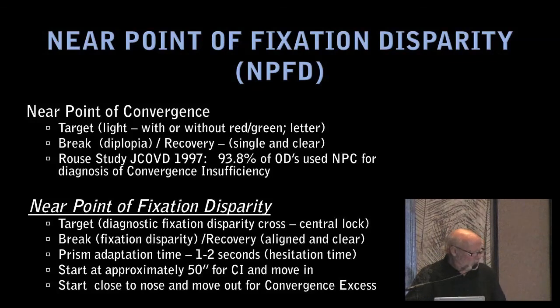Again, we take this target, and I'm using the large one to make it easier, and we're bringing it in until a fixation disparity manifests that cannot be recovered within a second or hesitation beyond that. Is it still sliding? Okay, now on the way in, I'll say, is the letter E clear? Yes. Tell me when the arrows start to slide. It's sliding. Is it still sliding? Yeah.